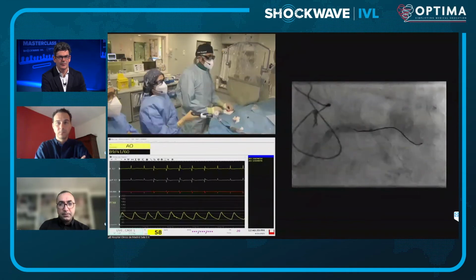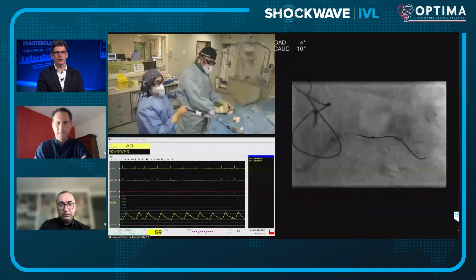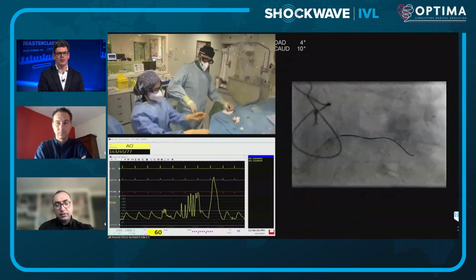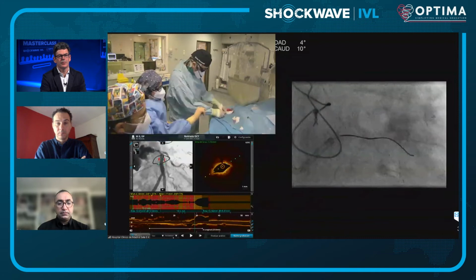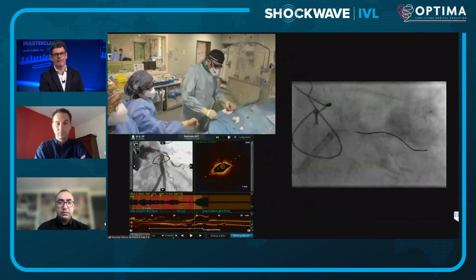Okay, good. We can deflate now, Nieves, I think. We have completed the energy life of this device, so we are bringing it back. At this stage, Nieves, my suggestion will be to perform a new OCT, so we can really understand what has happened. Obviously, I think there's been a huge improvement in the degree of stenosis there.